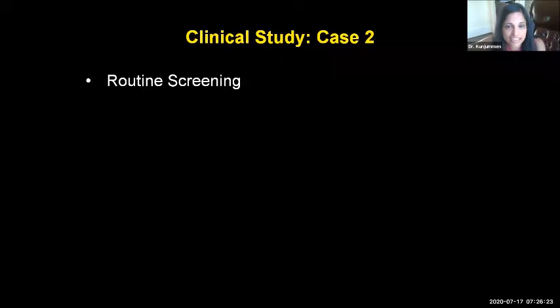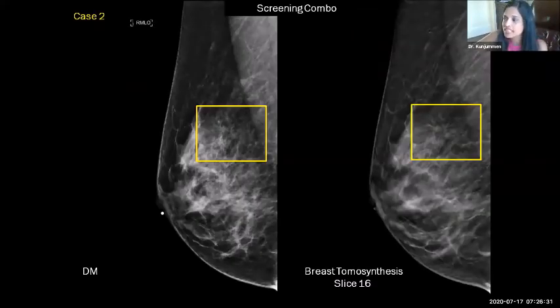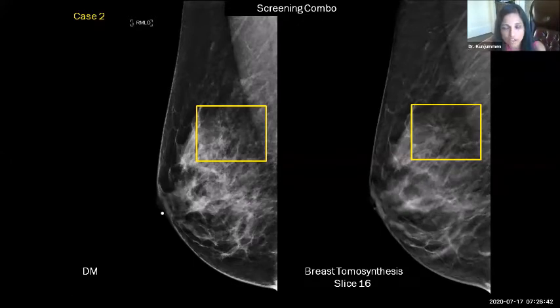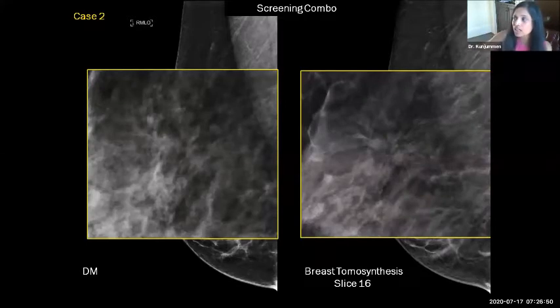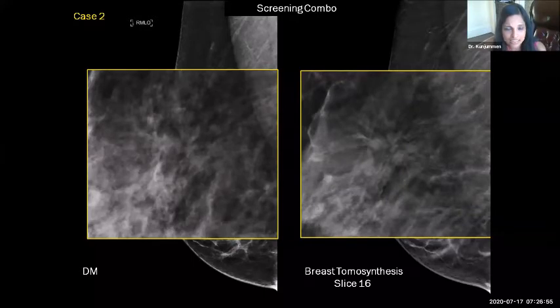The second case is a routine screening study. On the 2D digital image you really don't see anything on the 2D mammography. On the screening tomosynthesis, you can see a subtle architectural distortion, which is completely missed on 2D mammography. In this case, this was biopsy-proven infiltrating lobular carcinoma.